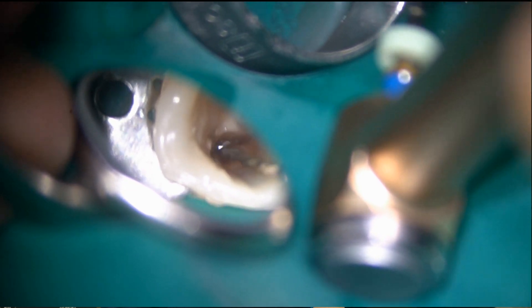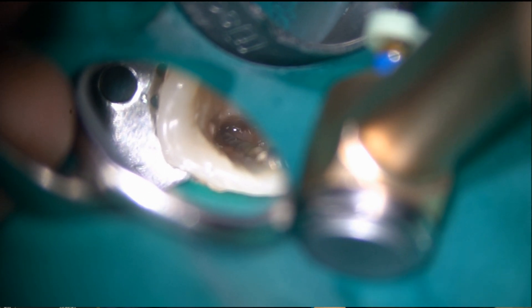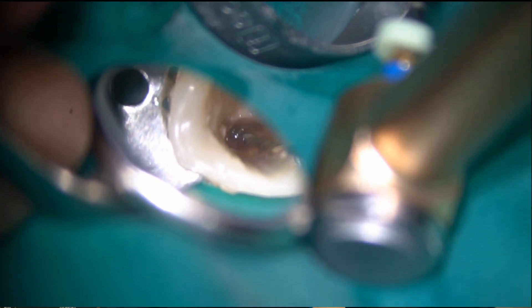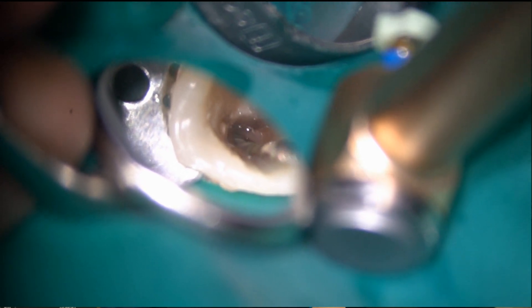You need to use just a small up and down motion, and you need to be very careful when doing this. I'm still using the reciprocating motion until I reach the broken instrument.